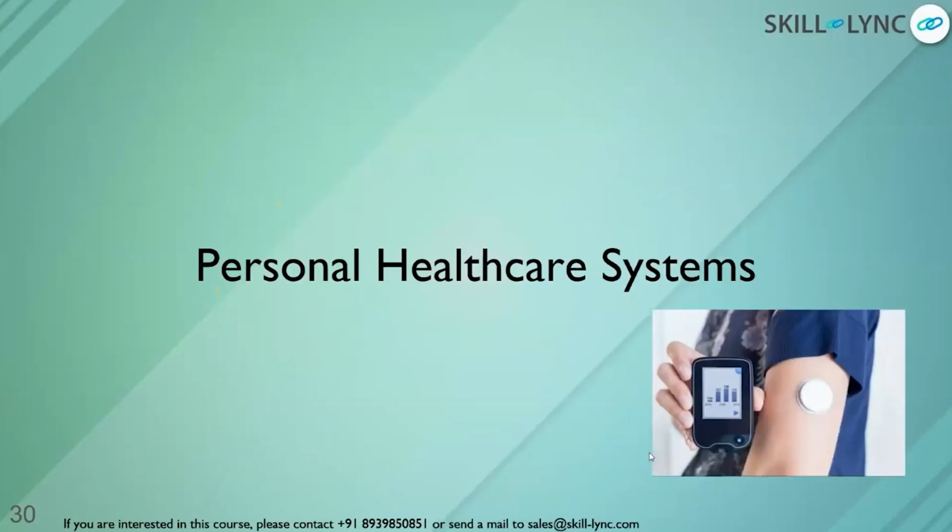So the next technology which we are going to discuss is the personal healthcare system, which is your wearable sensor. As you could see in the picture, you could see a small round patch. That patch is actually minimally invasive. You will have micro needles, very micro needles. It will be like an ant biting you. You will just pinch that. You will stick that micro needle onto your arm, where glucose sensors will be there.